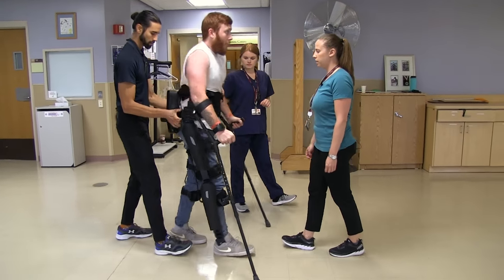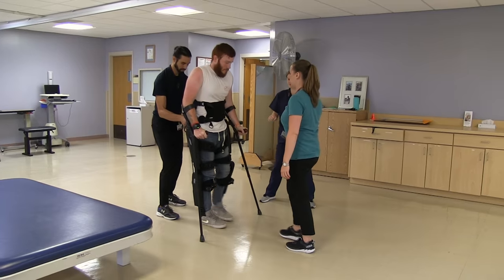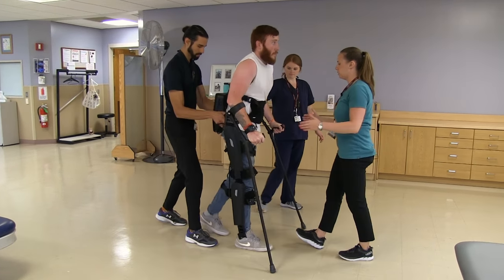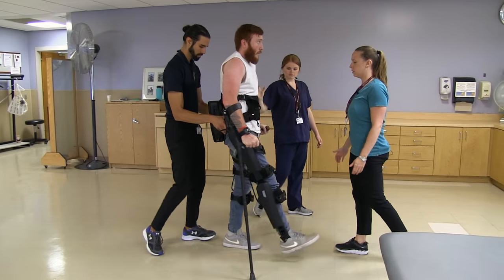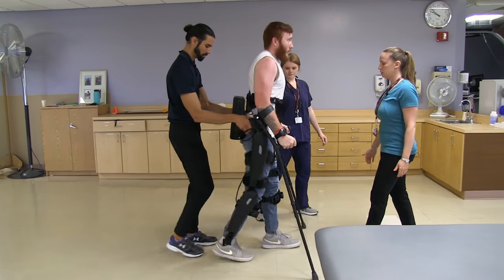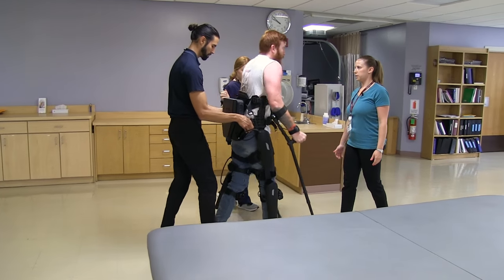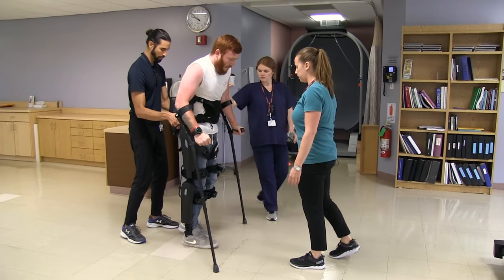The therapist coaches Keith during walking: look up, look up over my hip, keep your head up, try to shift with the hips coming first. Keep the head up — and scuff to stop.